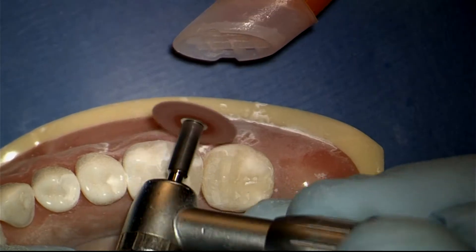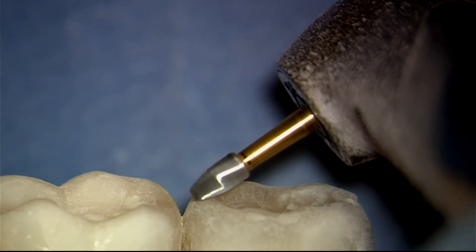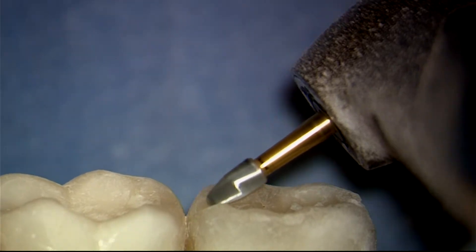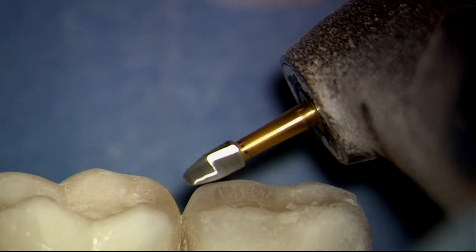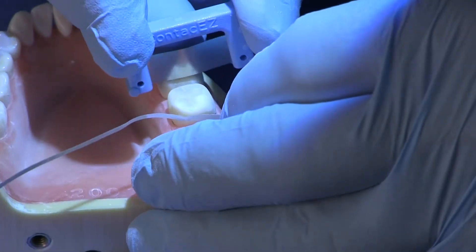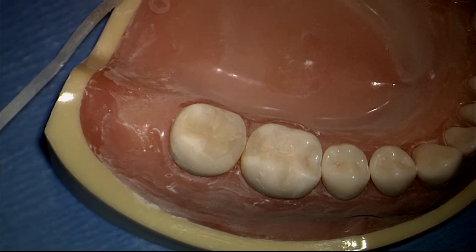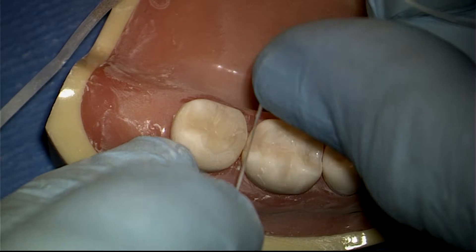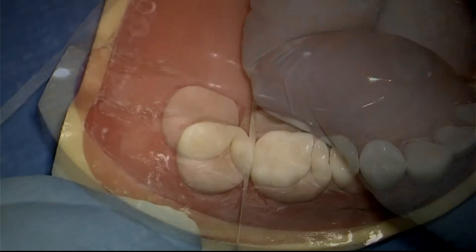Because the twin ring creates 5 pounds of separation and a diamond wedge up to 3 pounds of separation, the net separation pressure is up to 8 pounds. Get ready for tight contacts. In order to get floss and finishing strips through the contact, it is usually necessary to slide the blue true contact polishing saw through the contact, then use wax floss, and finally the composite polishing strip.